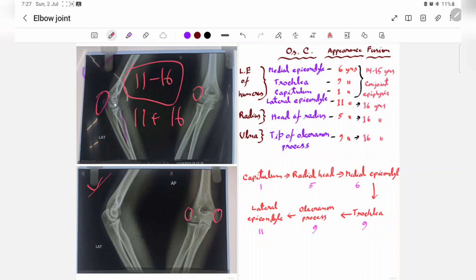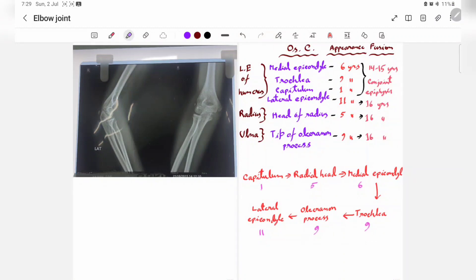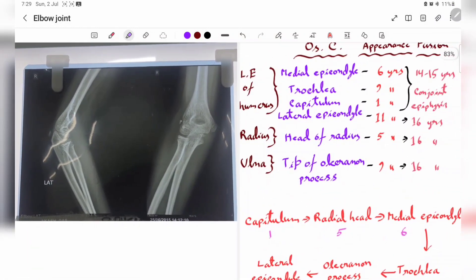In this fifth X-ray, the medial epicondyle, lateral epicondyle, head of the radius, and olecranon process have all already formed and fused. Therefore, the person is 16 years or older.